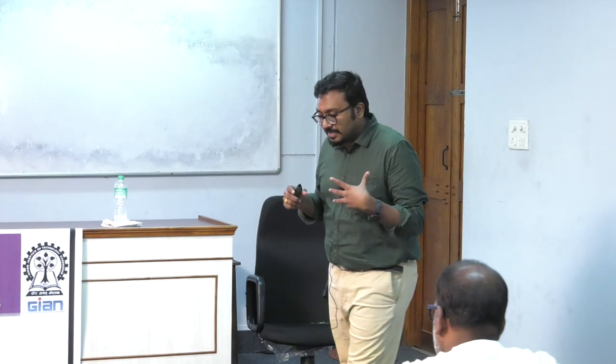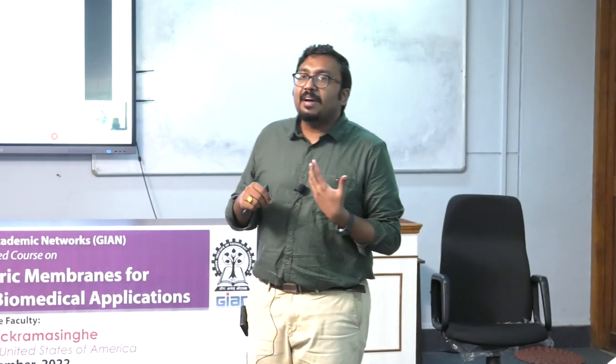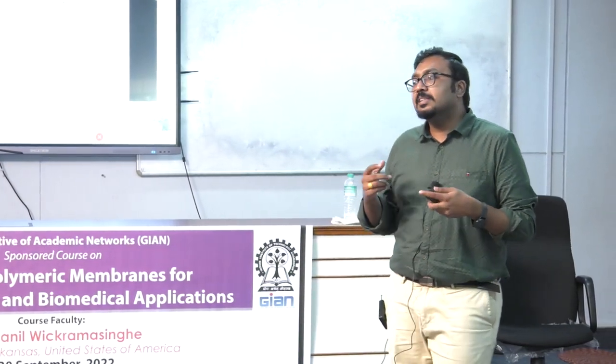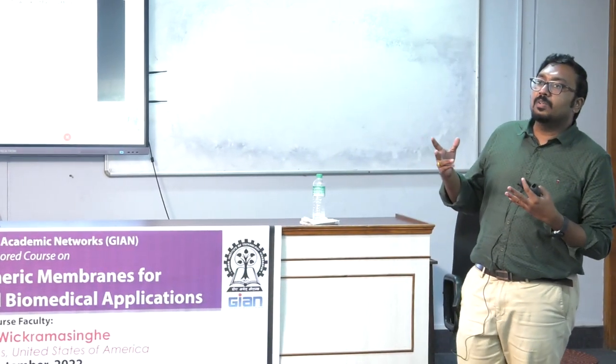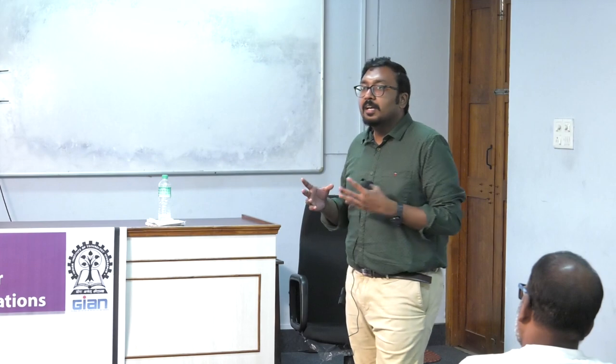Complement activation, very simply put, is when you have allergic reactions. You have heard of allergic reactions, right? An allergic reaction is your body not agreeing to something that has been inside the blood or on the surface of your skin. So the body is not agreeing with something that your blood has been in contact with.